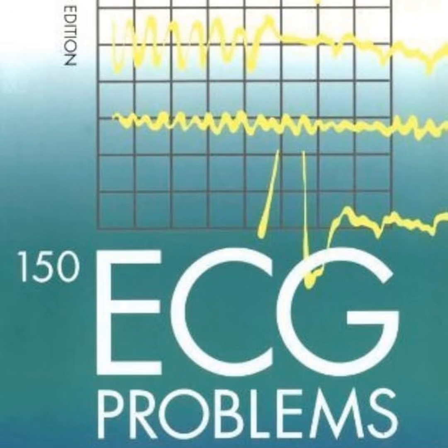So, patient B. The broad QRS complex tells us the depolarization is not utilizing the His-Purkinje system at all. It's originating from within the ventricular muscle itself and spreading slowly, cell by cell. So this is ventricular tachycardia. It is, and the absolute most critical clinical pearl here from the text is a fundamental rule of emergency medicine.